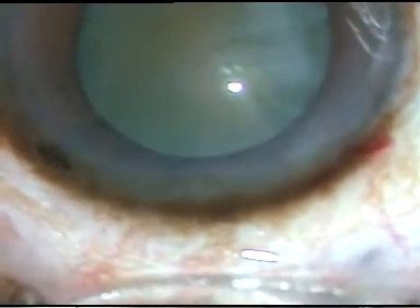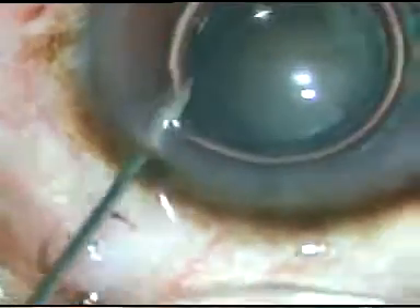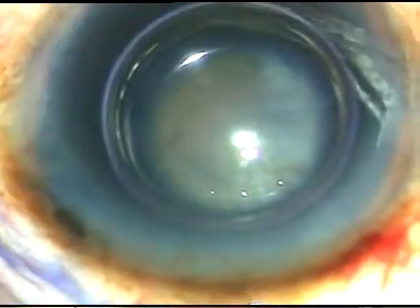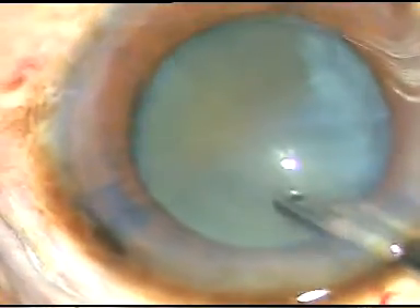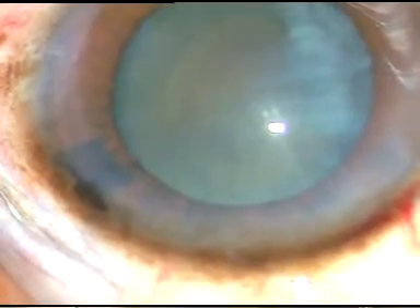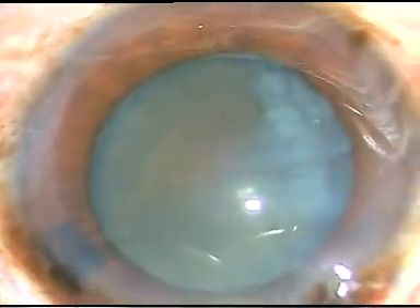A big air bubble is injected into the anterior chamber, and I stain the anterior capsule of the lens with trypan blue dye underneath this air bubble. The dye is washed out immediately afterwards. Then 2% HPMC, hydroxypropyl methyl cellulose, is injected into the anterior chamber, and the anterior chamber is filled up with this OVD.